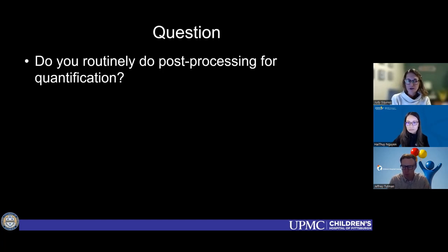Okay. But I will say it's not particularly user friendly, and for me, the information is less helpful. A lot of the studies you read will either use homegrown software where they export the images and data to separately quantify and get absolute decibel levels, or they use something called, what is it called? I'm blanking. ViewBox, I think, from Bracco, but you can't actually get that in the United States unless you're a big time researcher in the adult world, because it's not approved for anything other than animal research.